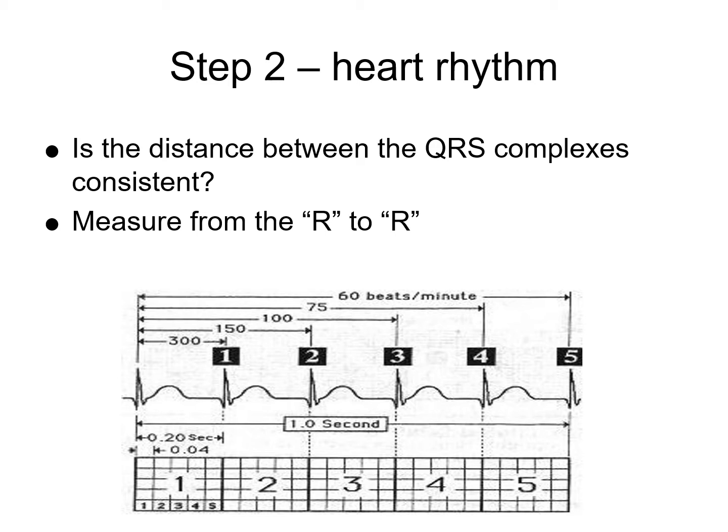I mentioned that in Beasley, there are a couple of pages that can help you figure out these different ways of calculating the heart rate. The R to R interval is the large box method, and that's what this is referring to.